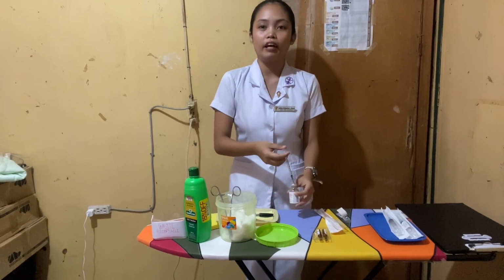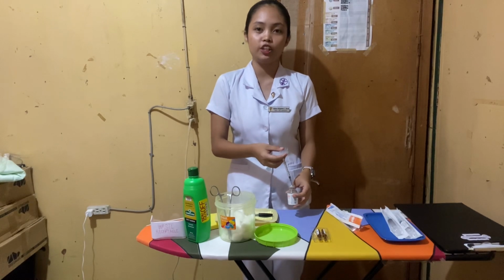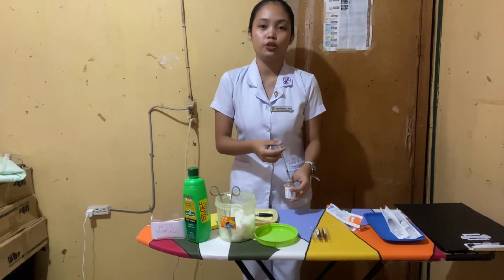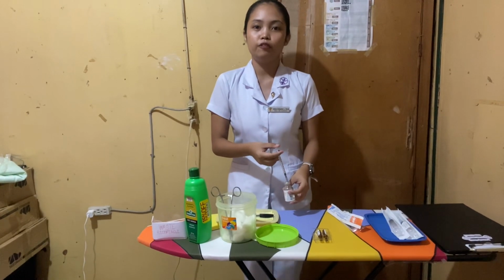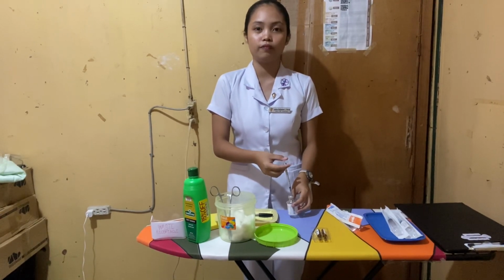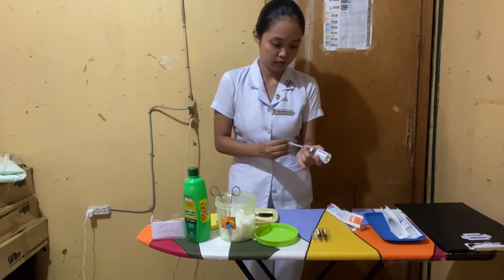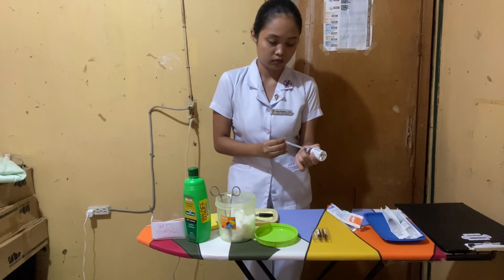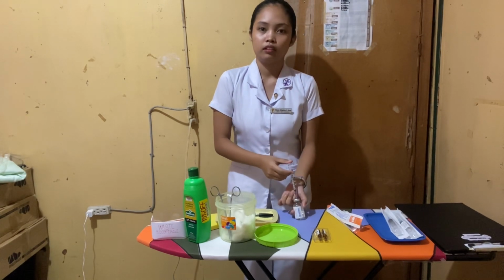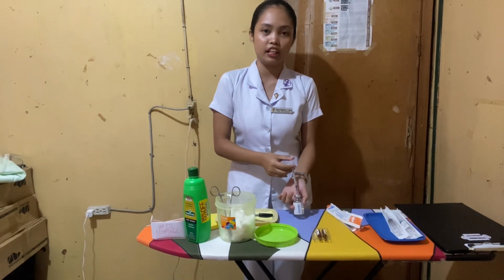Pushing air into the vial will prevent a vacuum from forming, and if you put too little air, then you will find it hard to draw out the medication. And if you put too much air, then the medication might be forced out of the syringe. So I'm going to insert this syringe and draw the exact amount of medication needed.